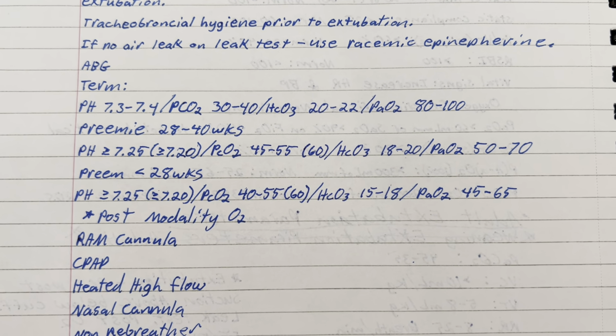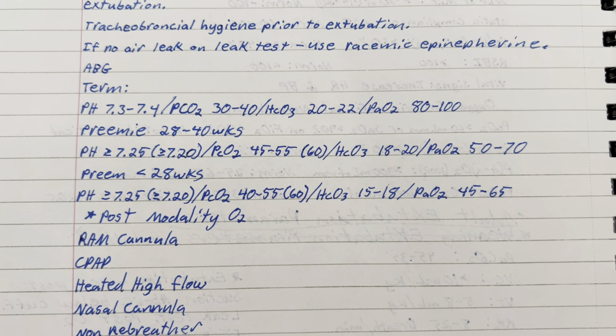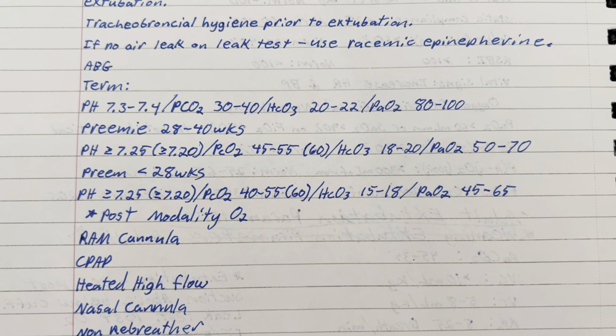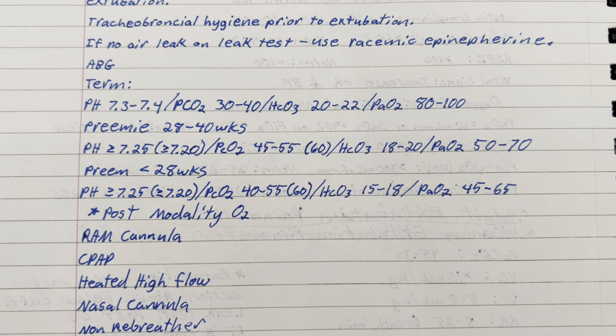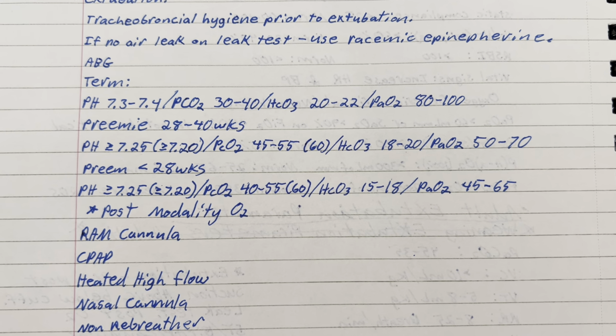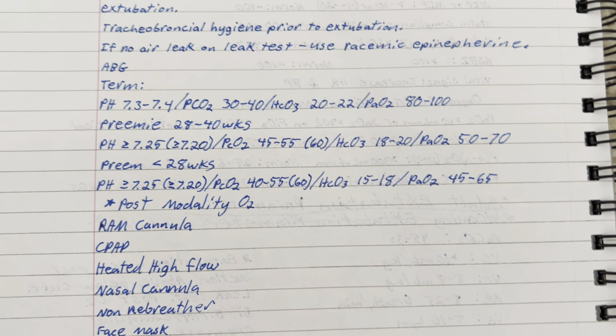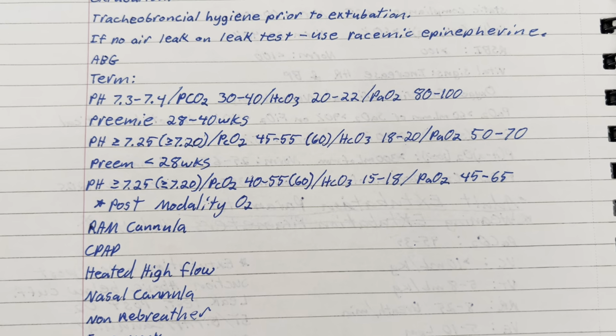With suctioning, you don't want to poke the carina, so you only want to go a certain amount down, not all the way down. You want it to be less than 10 seconds.